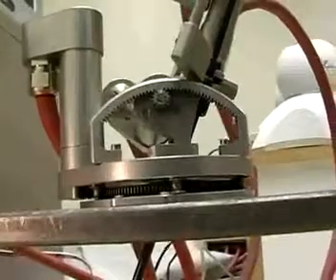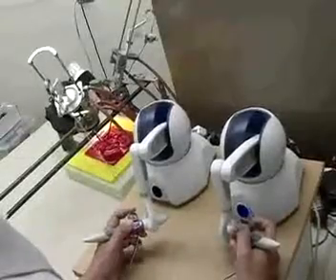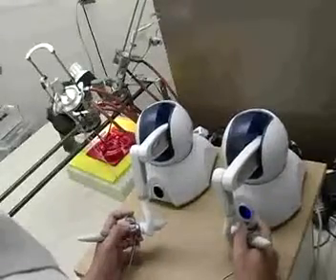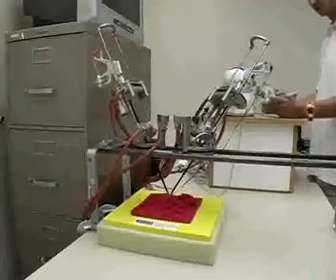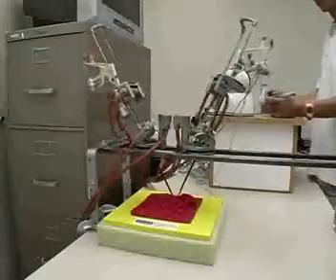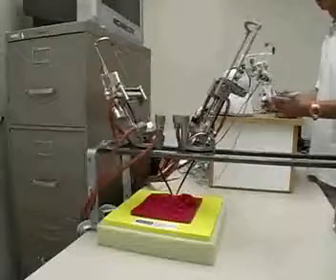As the manipulators are fully waterproof and sterilizable by autoclave, no draping or other special preparation is necessary for use in a sterile environment. The manipulators can be cleaned, stored, and sterilized using the same procedures as those used for current standard surgical instruments.